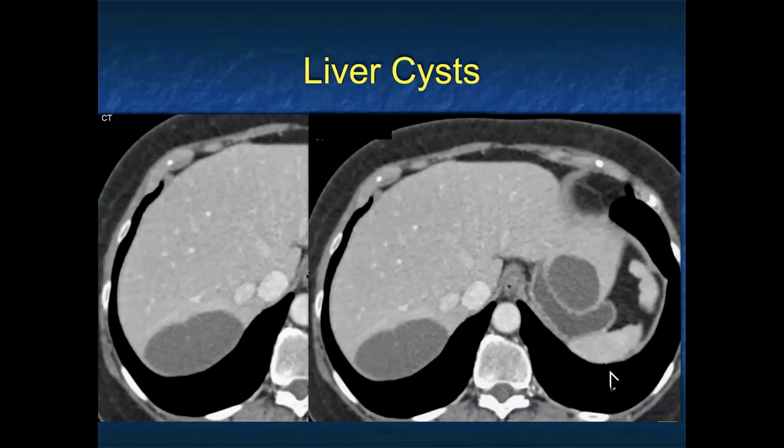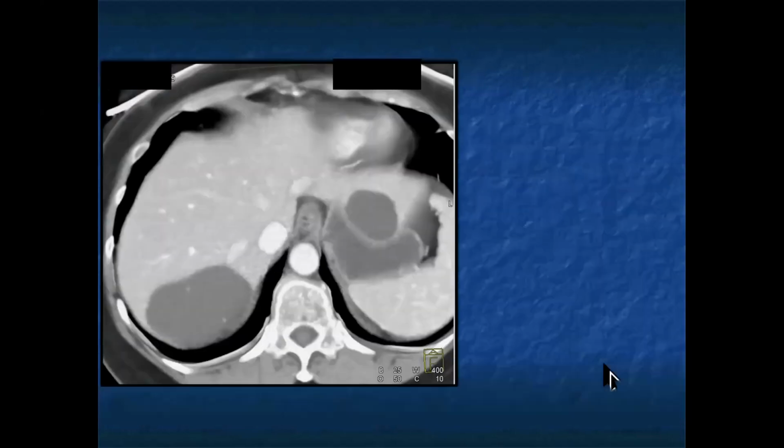When you talk about liver cysts, what you typically are saying is there's a lesion, it's water density, it's well-defined. There's no enhancing walls. Almost never does the wall calcify. Usually calcifications relate to prior trauma or to infection. Well-defined, single or multiple. They don't typically cause perfusion changes in the liver.